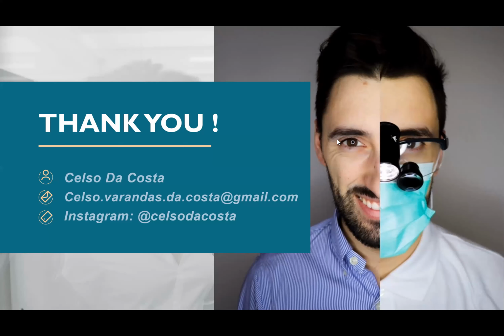With the touch, I need more time. Normally, like I said, 3 to 4 cycles of 8 minutes. So I need to ask them to come another day. And I always do X-rays and a check-up with the dentist before using the touch, because you're going to spend more time in the mouth of the patient. So I want to avoid some problems, like an interproximal cavity that I haven't seen. Just in that case.